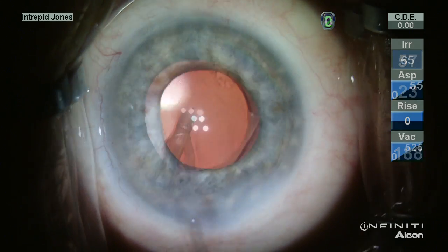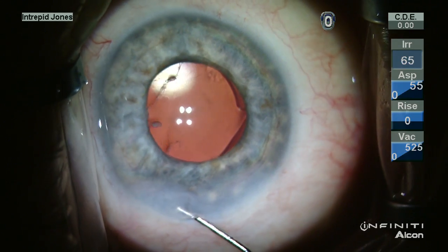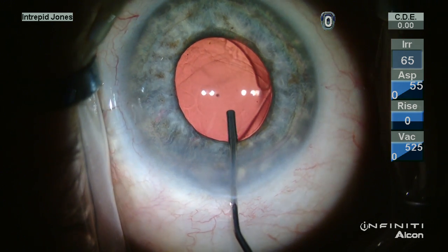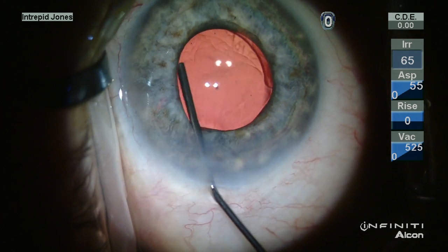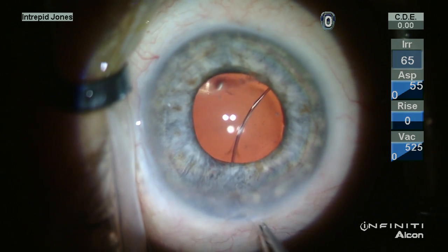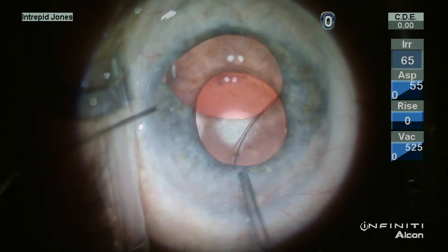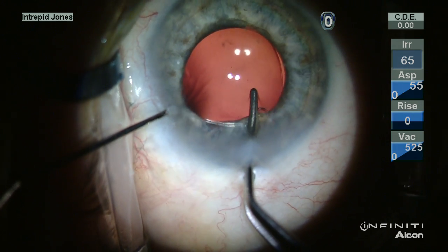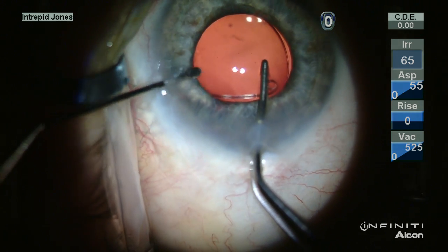It appeared relatively centered at first, and then once viscoelastic was removed, it was apparent that this was not the case. So under additional viscoelastic, a manual placement of a capsular tension ring was performed.